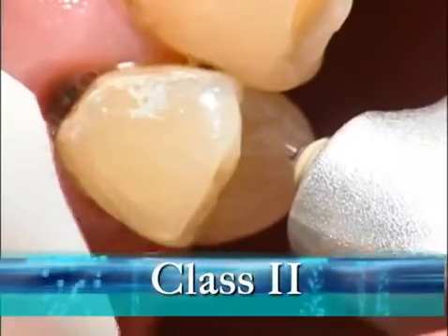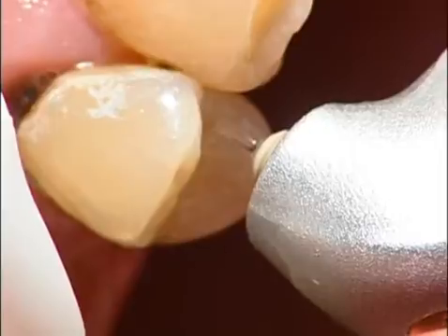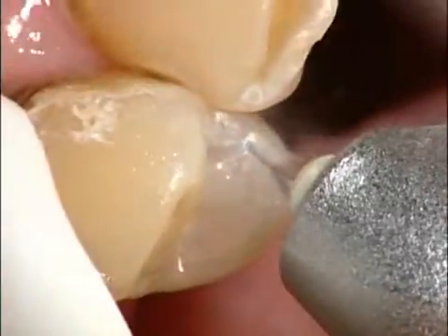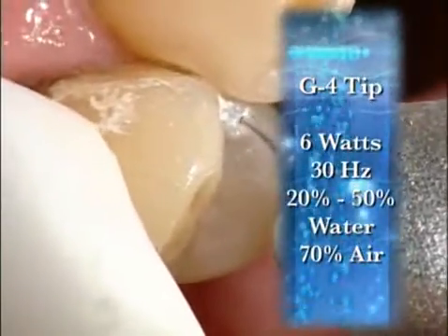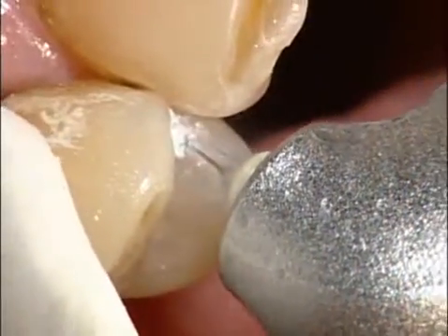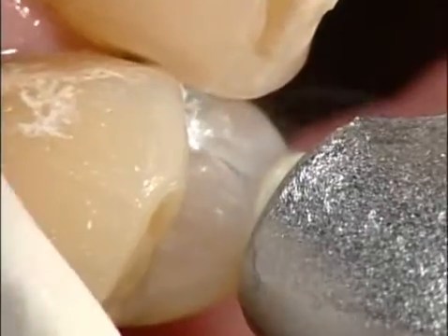So I'm going to do a typical class 2 slot prep. I'm going to start with the G4 tip, 6 watts, 30 hertz, with 20 to 50% water and 70% air.